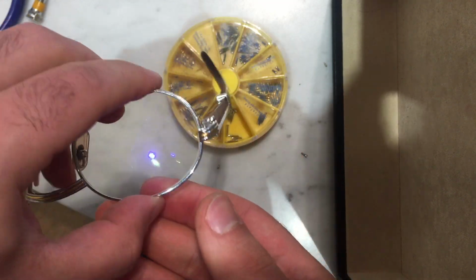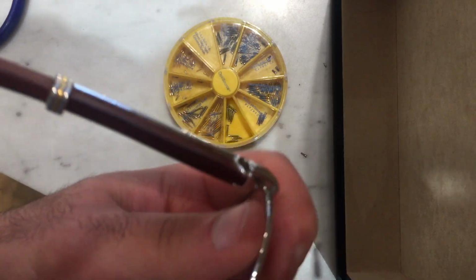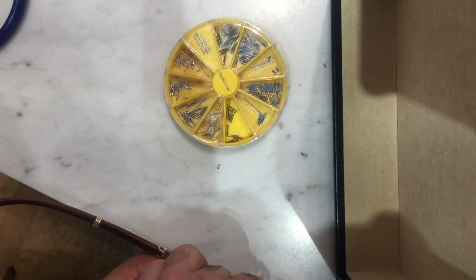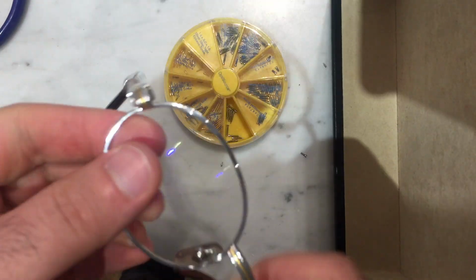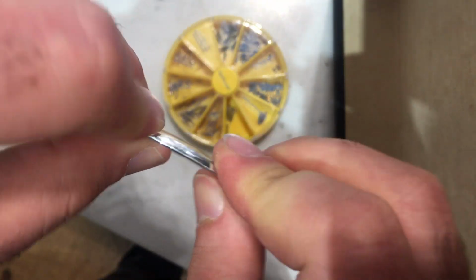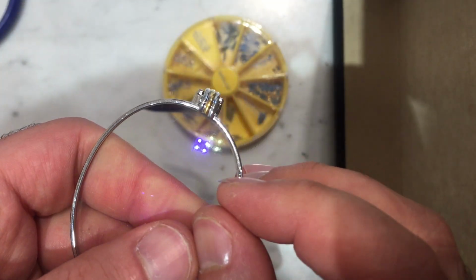Bam, and we're in, and it's already tighter even though I loosened up the screw a little bit. So we'll go ahead and screw that back in. Use this for anchor. And look at that, we're in there. The lens is nice and tight. You know, this may not even need a liner. That shows you how good this trick works.